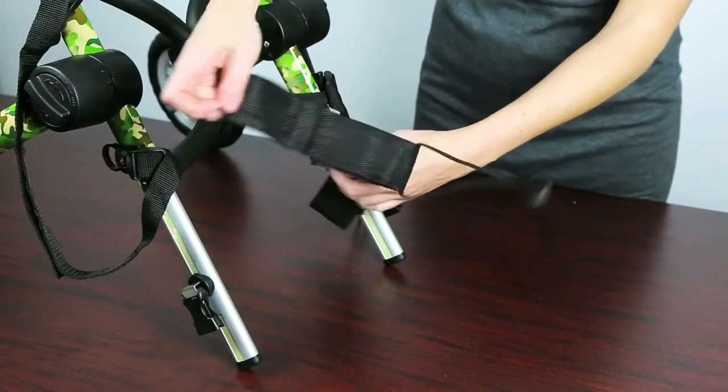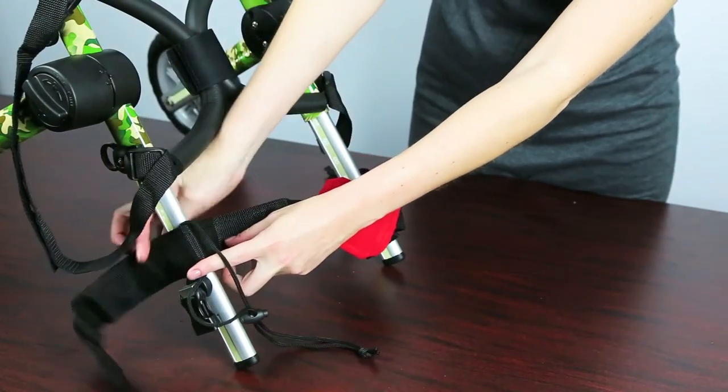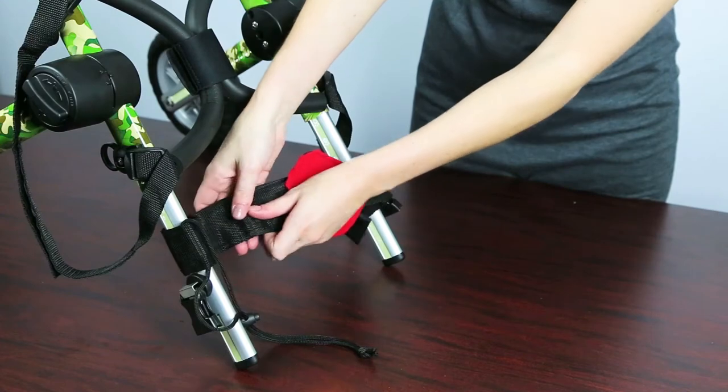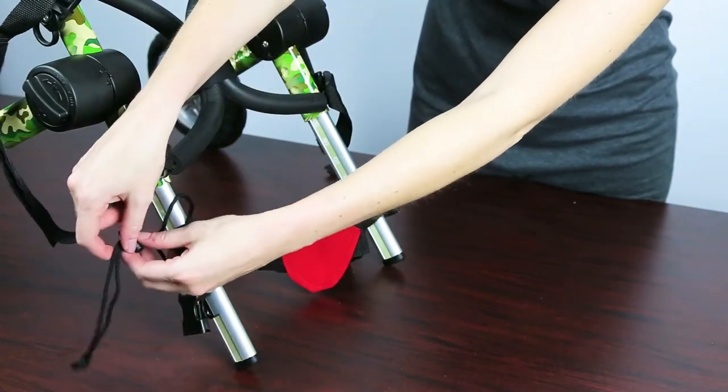Next, undo the Velcro on the other side of the belly belt. Put the Velcro side over the extender and reattach the Velcro. Put the rope around the side clip again and tighten.